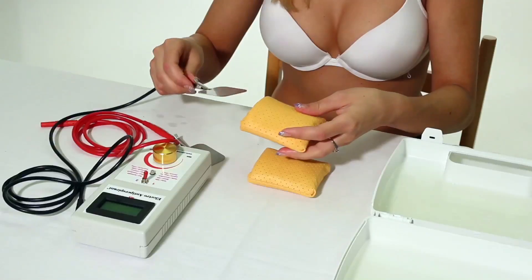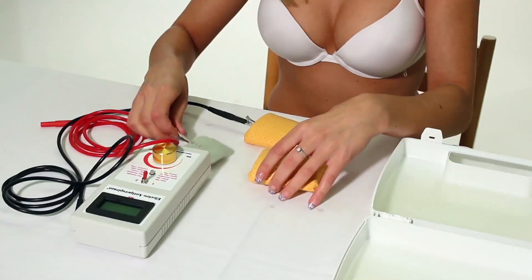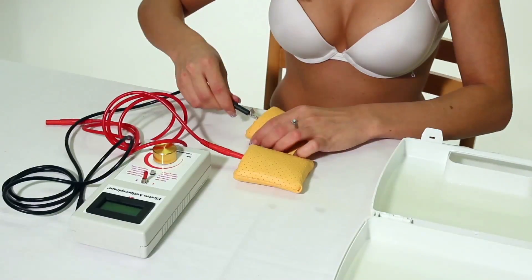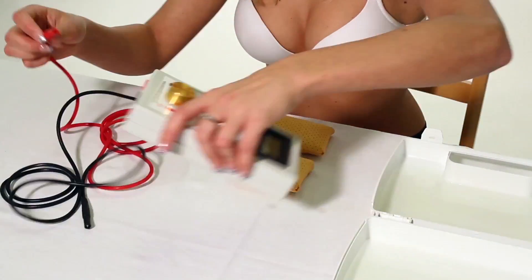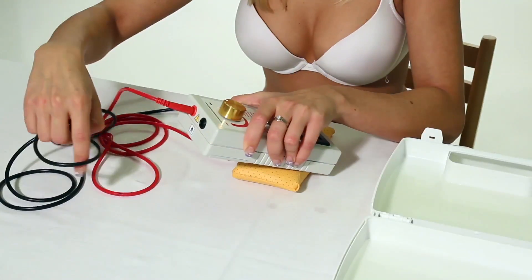Now insert the prepared electrodes along with the conductors back into the electroantiperspirant comfortable adapters as deep as it gets. Before connecting conductors to the electroantiperspirant device, read the attached instructions very carefully and follow the advice that you find there.